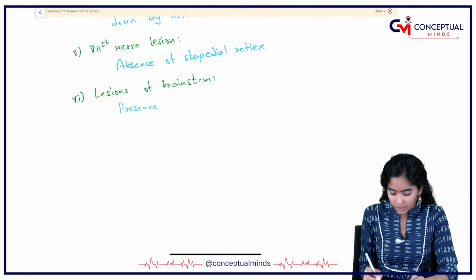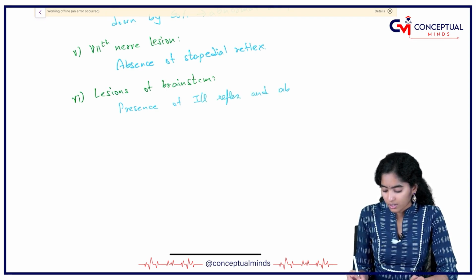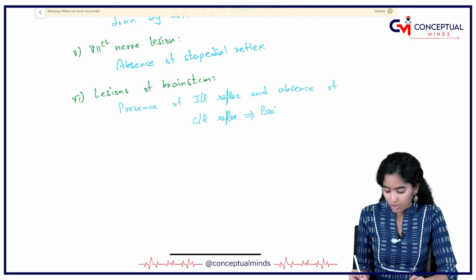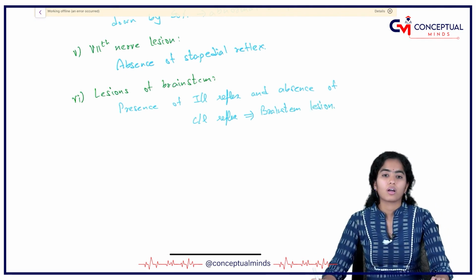Presence of ipsilateral reflex and absence of contralateral reflex is suggestive of a brainstem pathology, brainstem lesion.